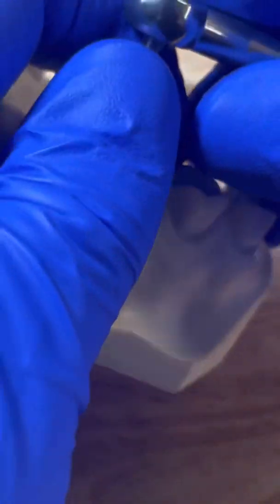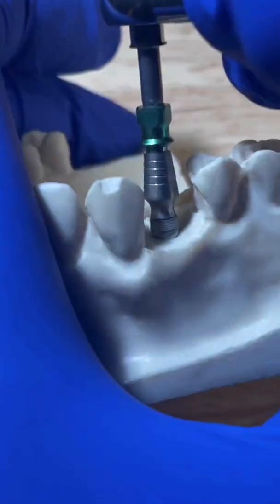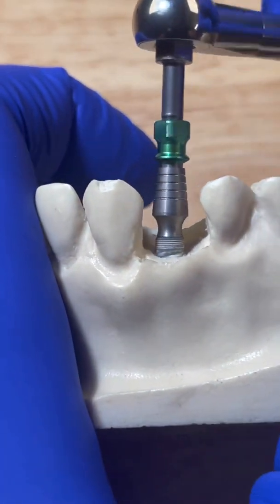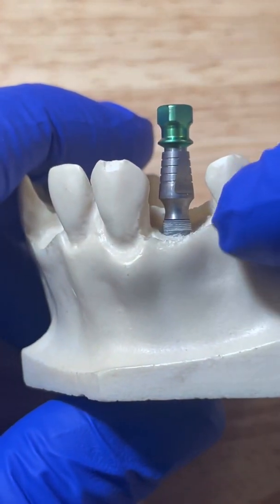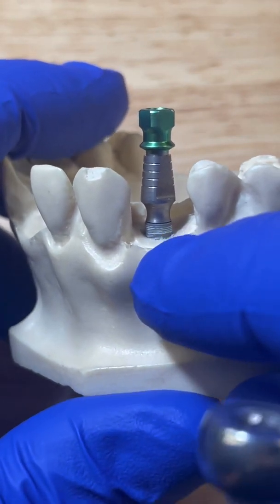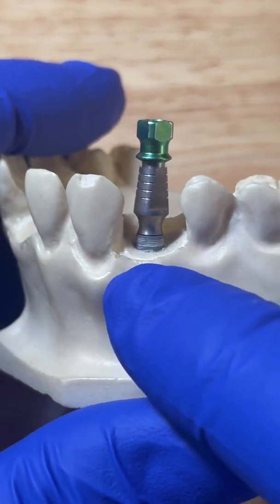You go two rotations in and then one rotation out. If you do that, you're actually able to expand the bone slowly. So you keep doing that — two in and one out, two in and one out — and eventually the implant will get all the way to depth, right at the crest or just under the crest of the ridge. And you'll have safely placed that implant.